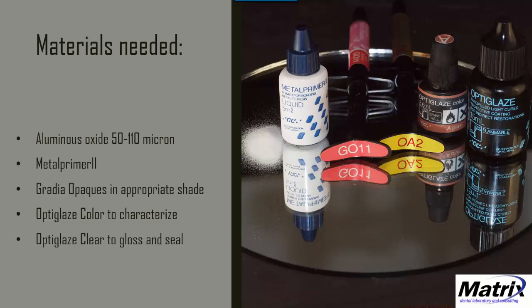To do this technique, we'll need several products: aluminous oxide to prepare the surface, metal primer, the pink opaques GO11, GO12, and GO13, tooth-shaded opaques OA2, OA3, and OA3.5. For this demonstration I'll use just the OA2. We'll also need the OptiGlaze Color Kit, preferably the A+, and OptiGlaze Clear to seal the whole thing.